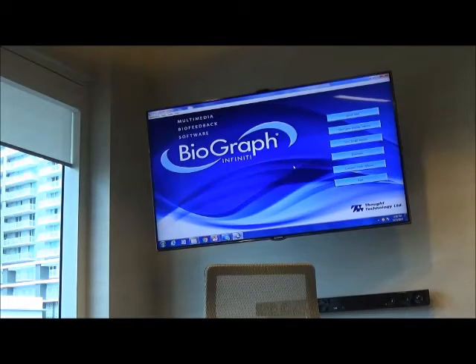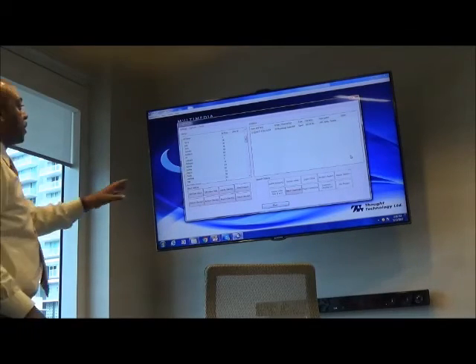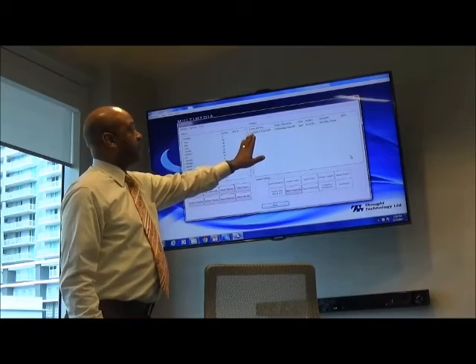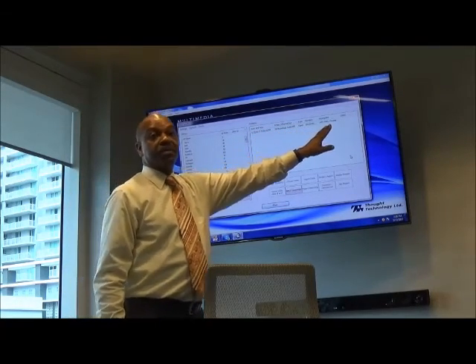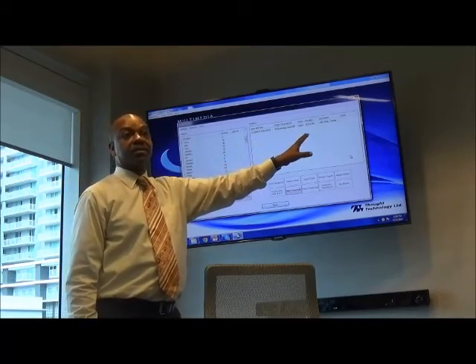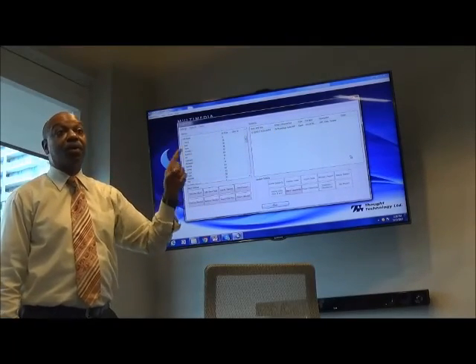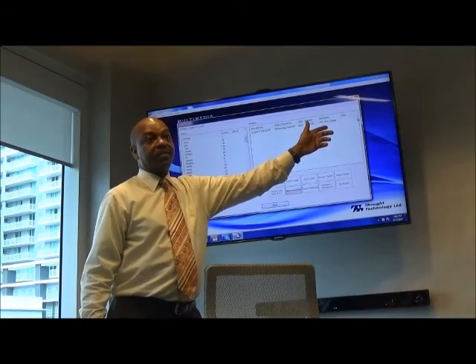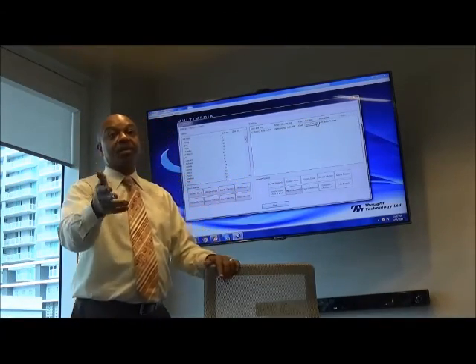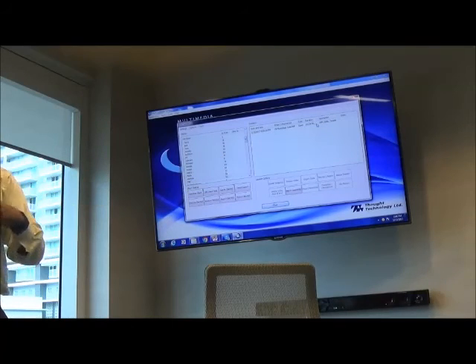Now if you, let's say it's three weeks later. Now you go to database and you want to look up what you did last time. So, you see on this, you have the person's name. You have the date and time. You have the channel set. The description. Yes. For me, I use that to tell me what sensors I use. Because in this channel set, I could have done all the sensors. I could have done one EMG. I could have done one temperature. I have no way to know. But if I put it here, then that tells me. Now if you did the same thing all the time with the person, then you don't have to do that. You could just have a code that's, you could just say multi-sensor or whatever.